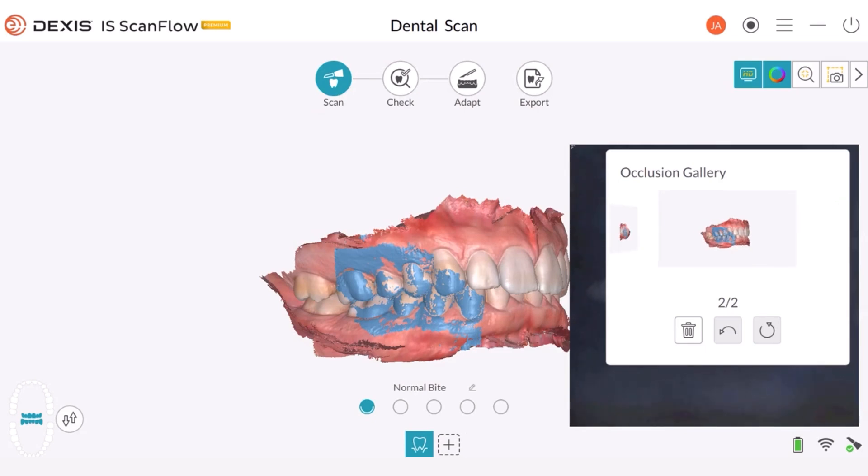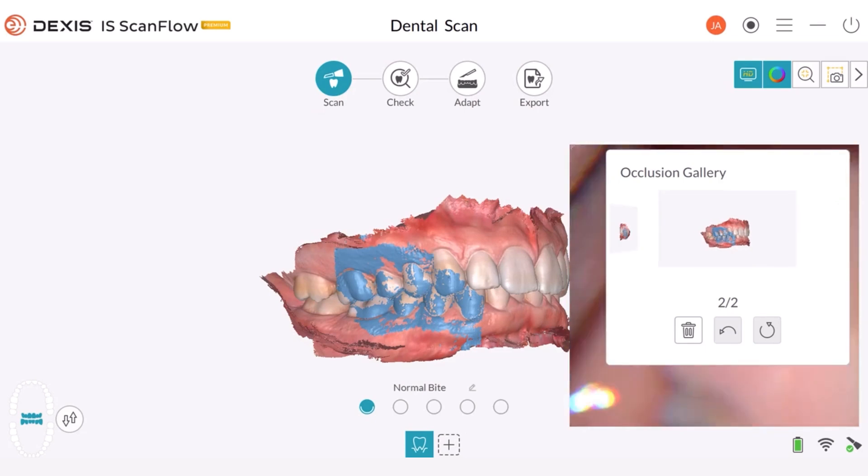If the bite registration remains elusive, maintain the same tip placement and gradually sweep from the top to the bottom, allowing the upper and lower dental arches to come together. We can do the same thing on the interior.